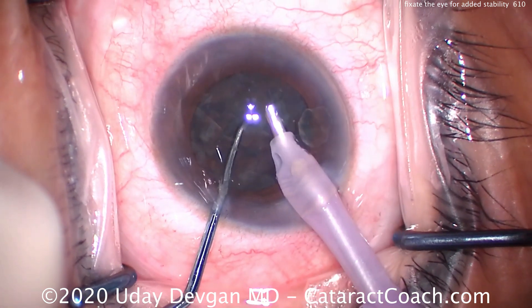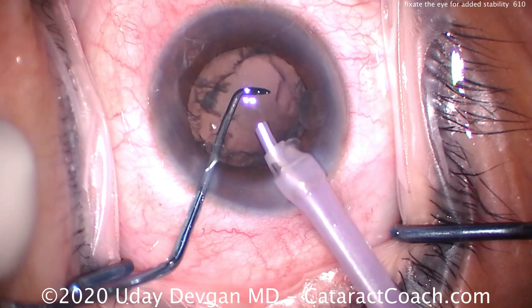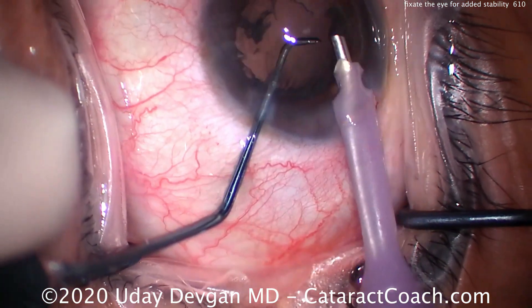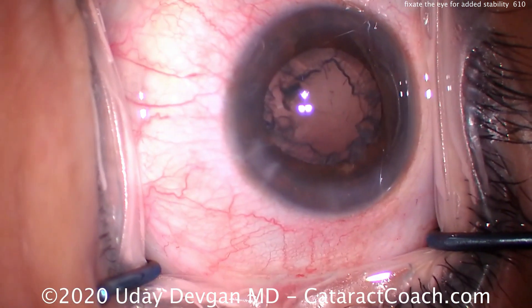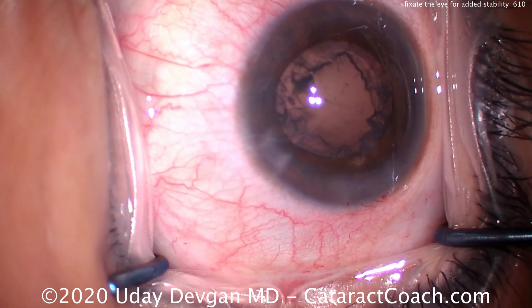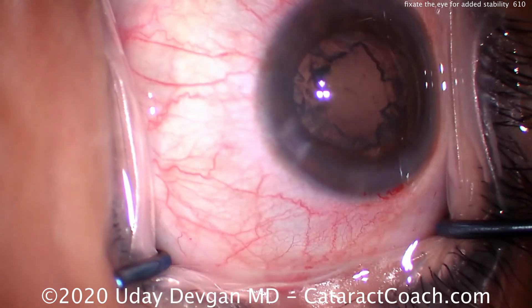The reason is we're resting our hands against the patient's face. Any movement, we move with the patient, and then we also retract the instruments. When you have that sudden jerky movement from the patient, especially with the phacoprobe, get the instruments out of the eye. By retracting those instruments, we were able to prevent any problems from that sudden movement by the patient.